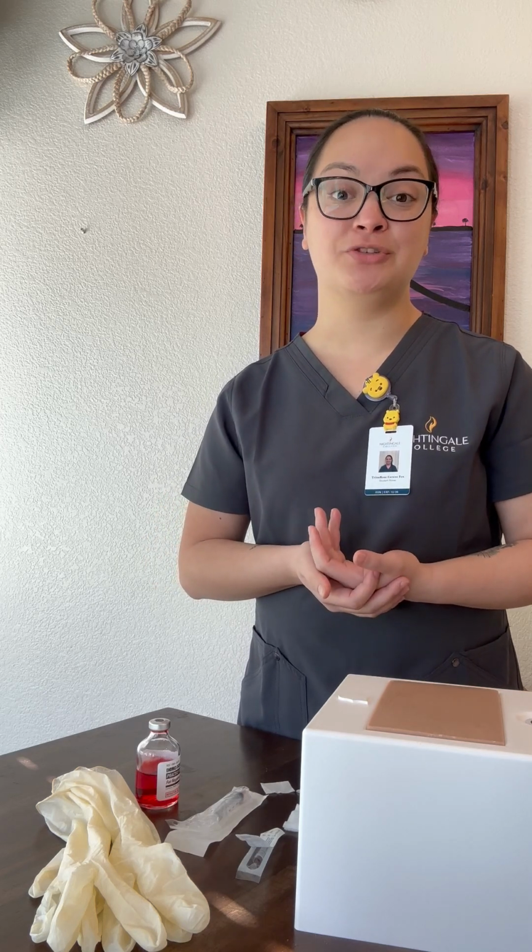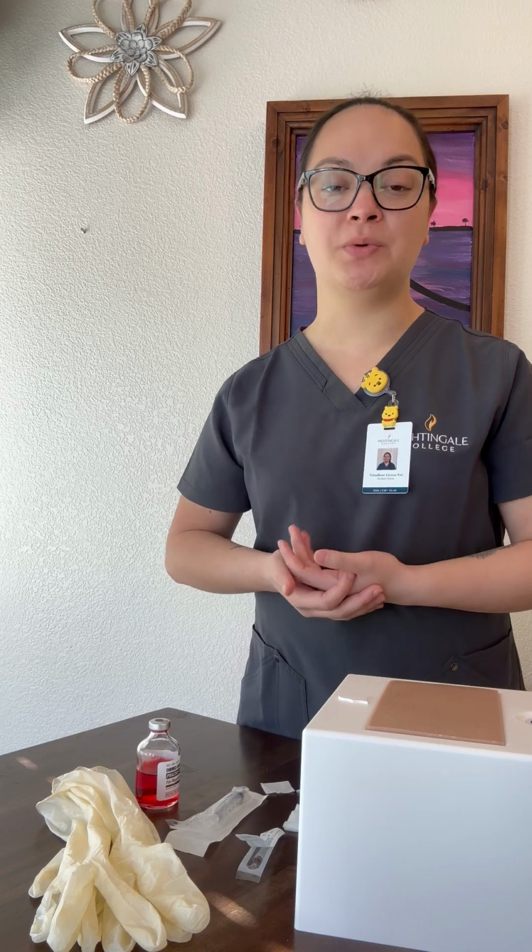Do you have any questions regarding the administration or the medication? No questions? Okay. So we will go ahead and assess the site, make sure there is no bruising, edema, inflammation, signs of infection, discoloration, and we will also palpate for tenderness or masses. Okay, site looks and feels okay. So we will go ahead and prepare our medication.